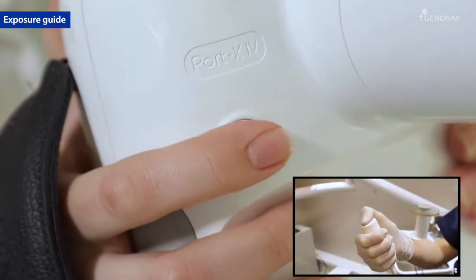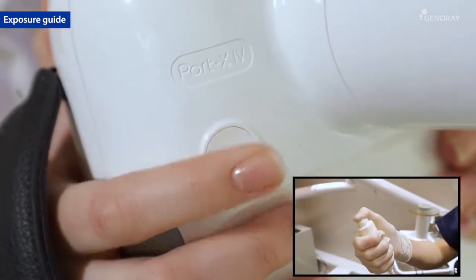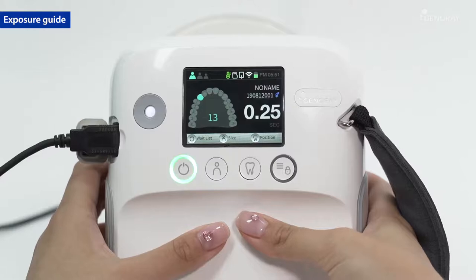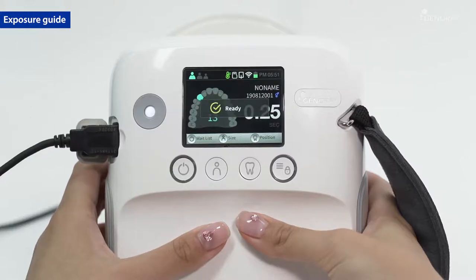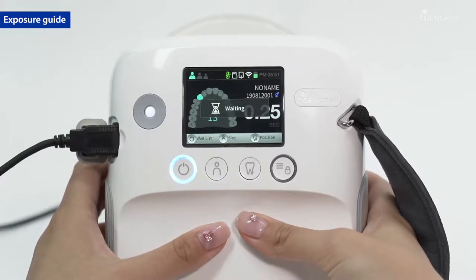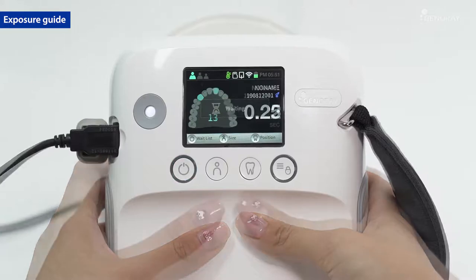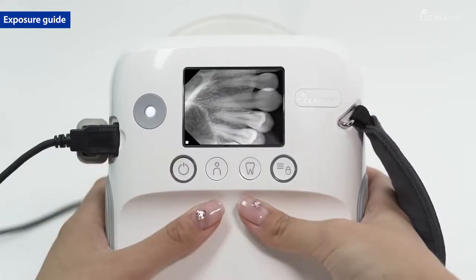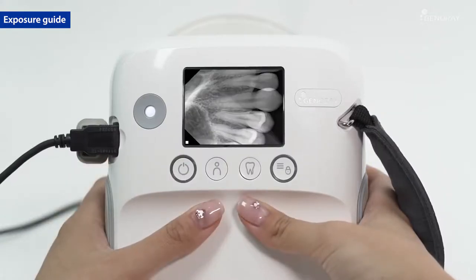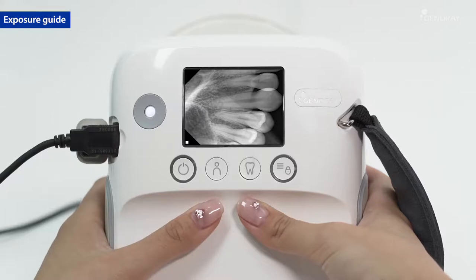Once you press the X-ray button, a ready sign will appear for about 2 seconds on the screen. When the unit is ready for X-ray exposure, a notification window will pop up and you will hear the alert buzzer. Review the images on the LCD screen once the X-ray exposure has been complete.